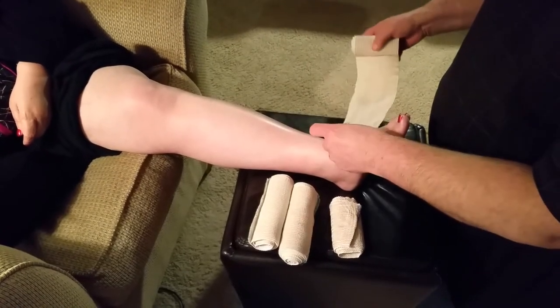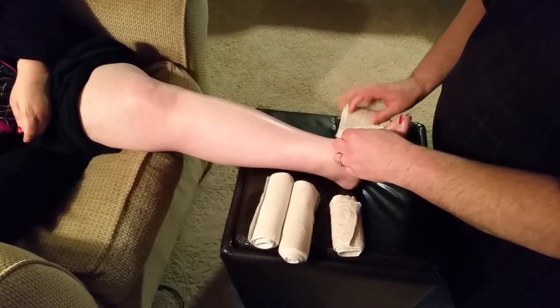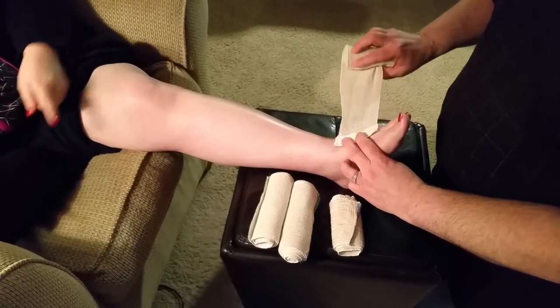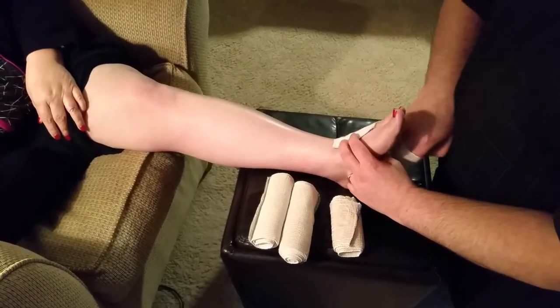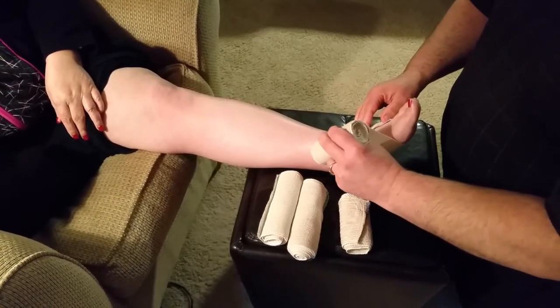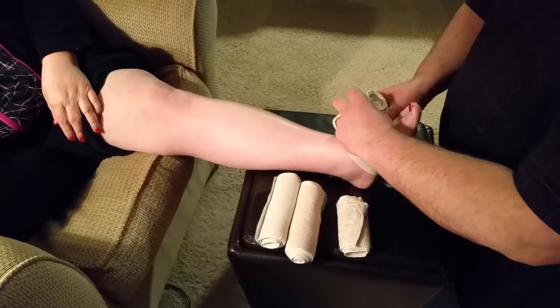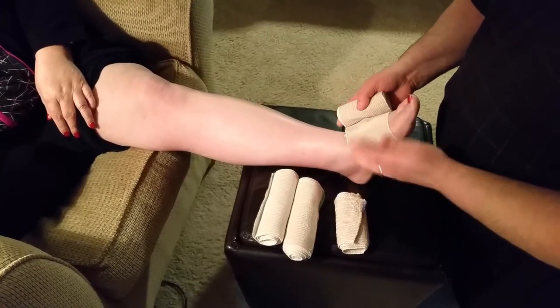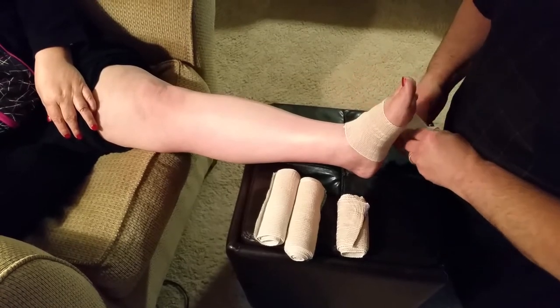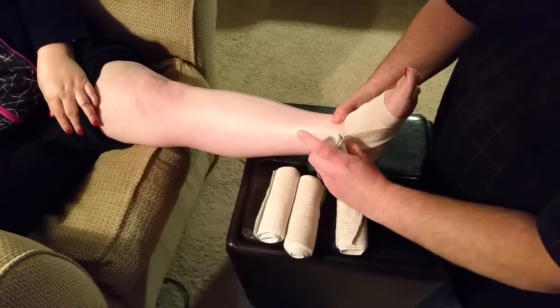These came with velcro already on them. I place the velcro end in the center of the foot, loop it up velcro side up, come around, give it that little bit of stretch it needs, and seal it.